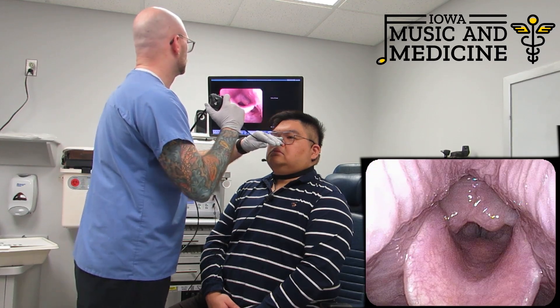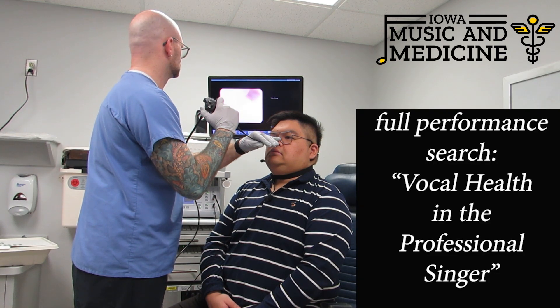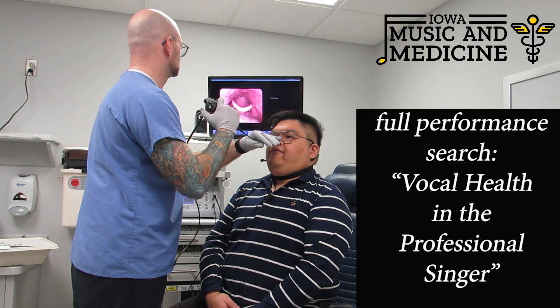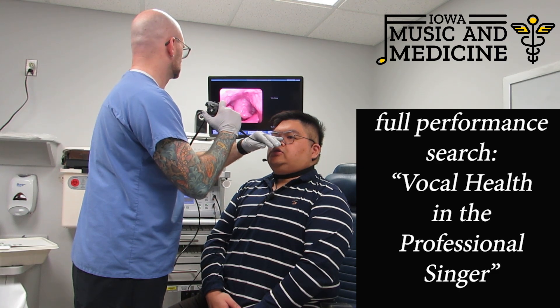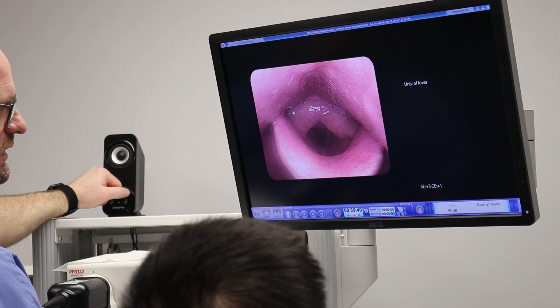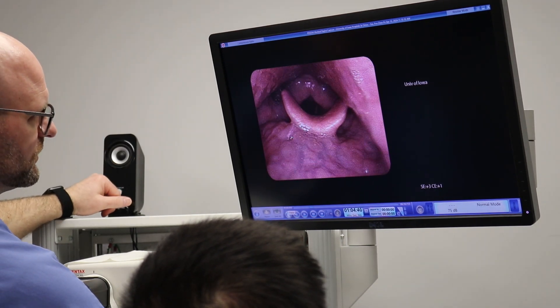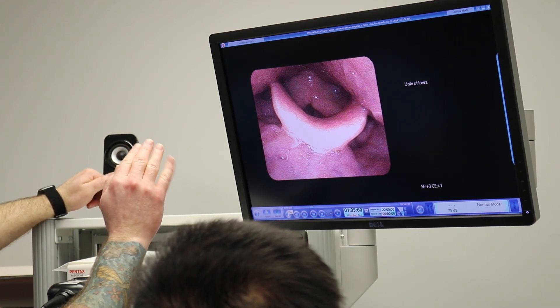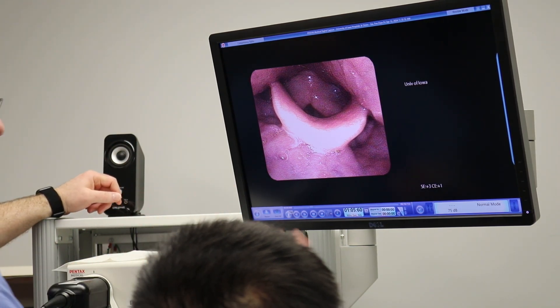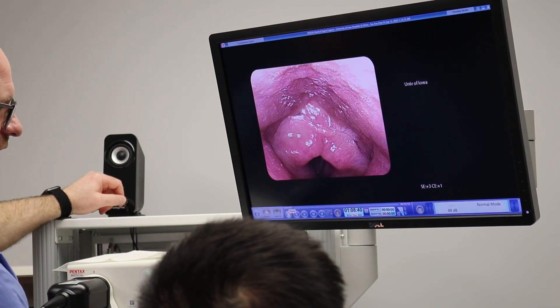If you're comfortable singing, I'm going to play the background so you sing with yourself. I had you swallow because when you swallow, your tongue naturally pulls back, and when that little bit of warm tongue touches the bottom part of the camera, it warms it up just a little bit, so that way the air that you're expelling doesn't fog up the camera when we're looking at your voice.